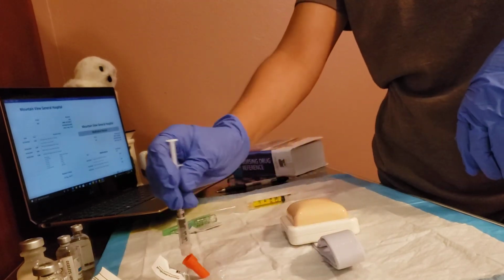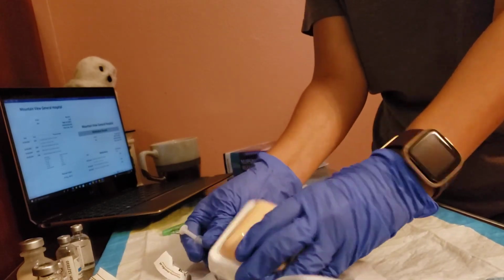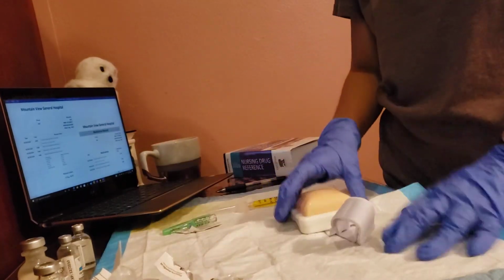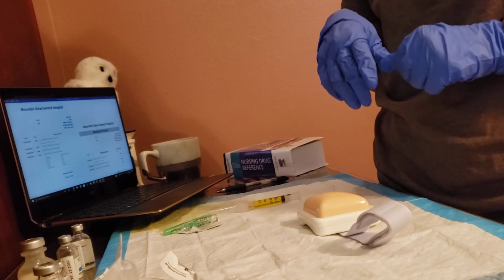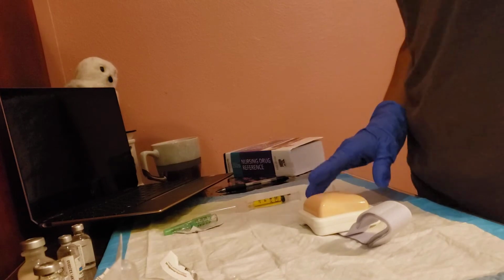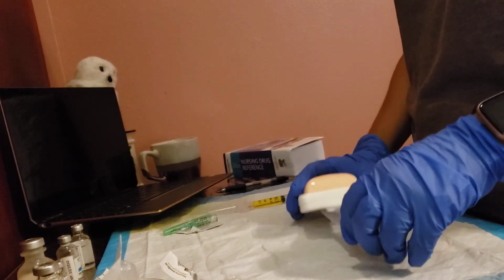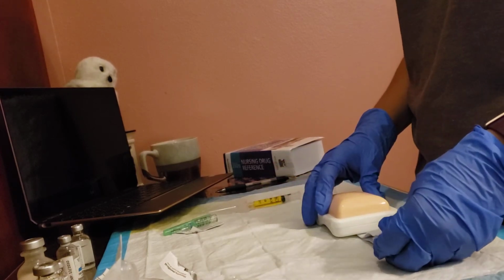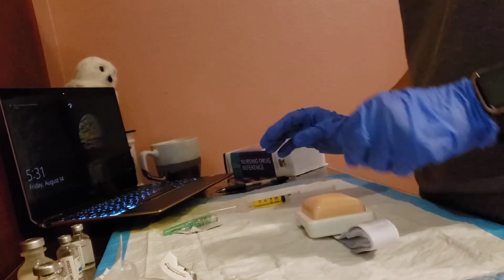I would throw this away in my sharps container because I no longer need it. I would throw that away as soon as I used it into the sharps container and be done with that one. And I want to make sure that when I give him his insulin, that he does have his tray around and near him, and that he's able to have some food with it. And I'm gonna move on to my antibiotic.